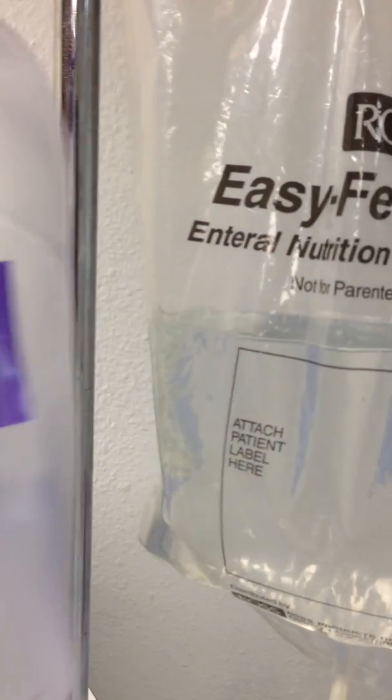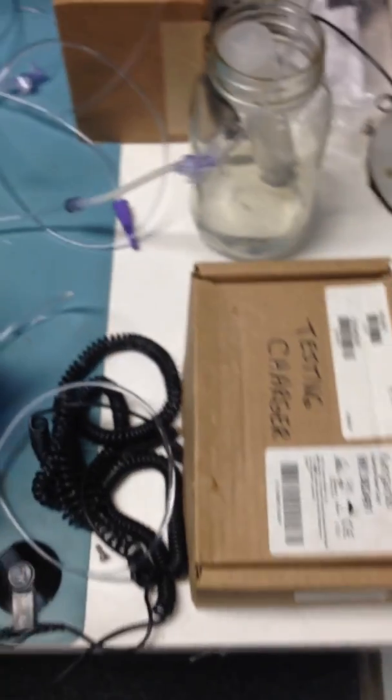This is the external feeding pump bag, which is usually filled with food for the patient, but we're using water. The sensor — you want to attach this here. This tubing is going to get wrapped around the rotary and connected to the sensor.